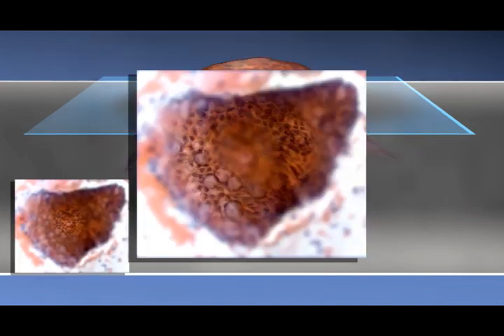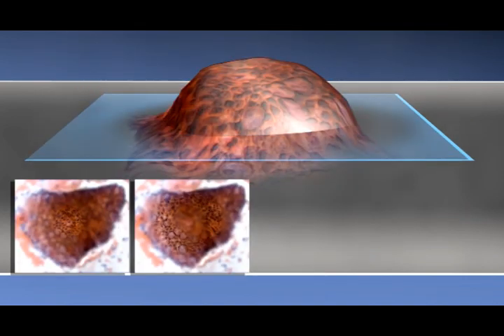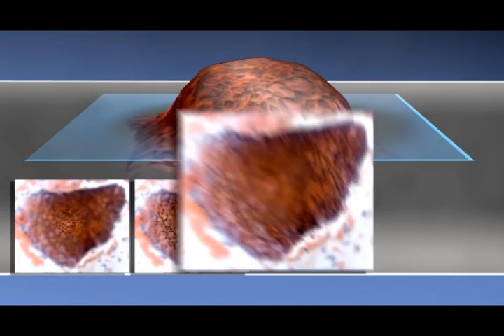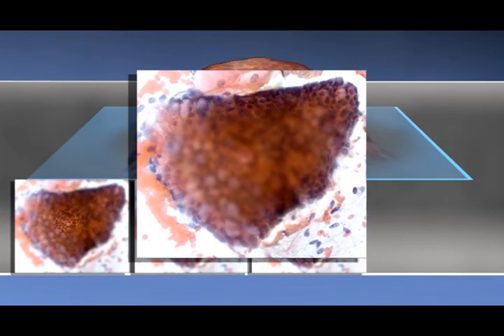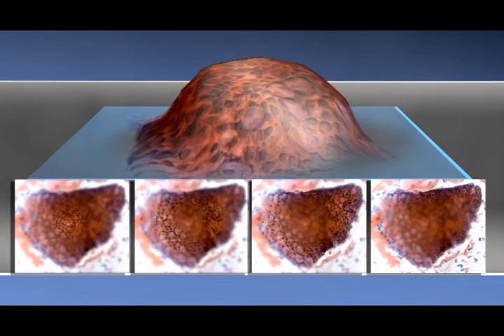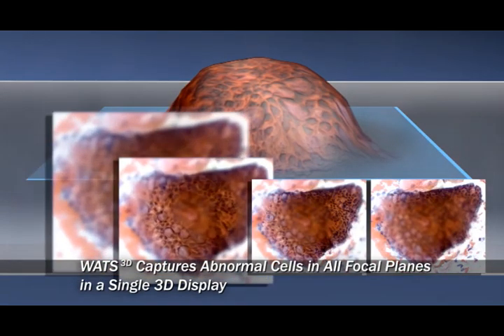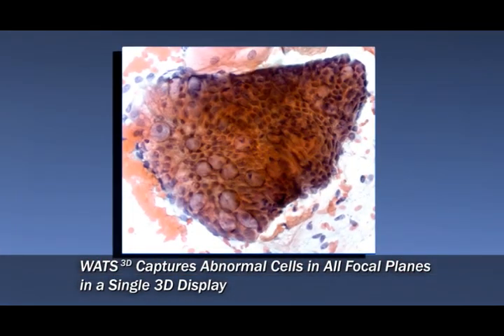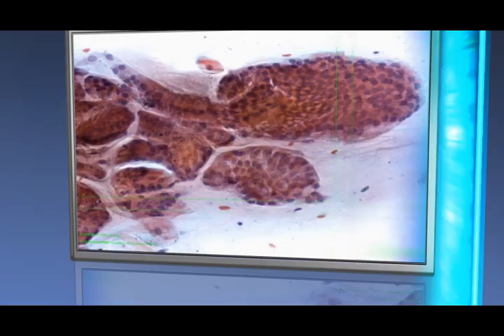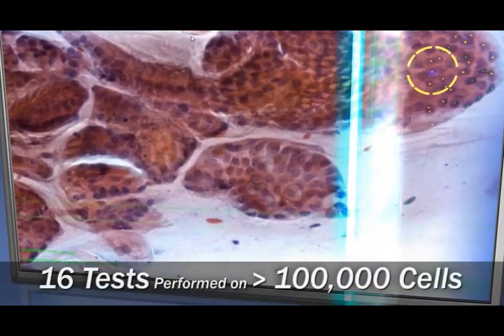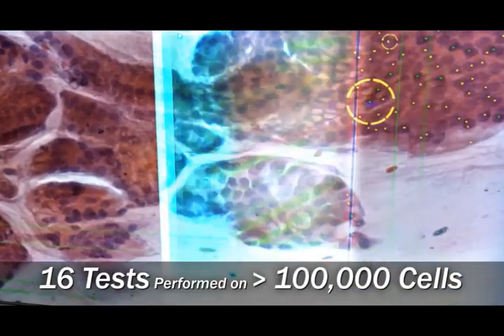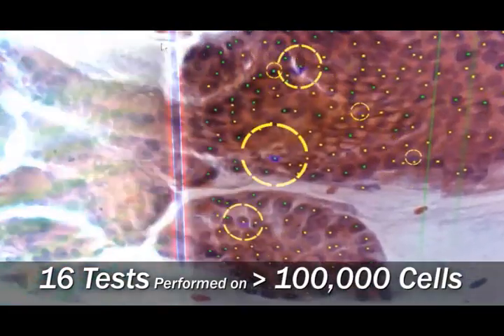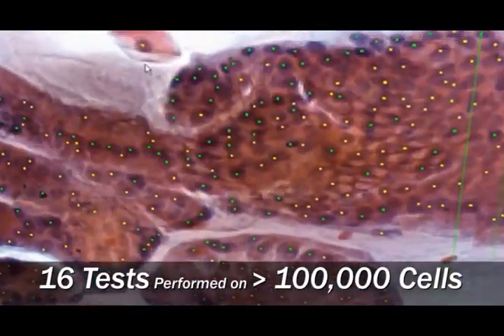By electronically cutting the specimen into more than 100 layers and then creating a synthetic combined image using proprietary technology known as EDF, each cell is in focus for analysis. Scanners tag every cell, and the analysis consists of 16 different optical tests on each.